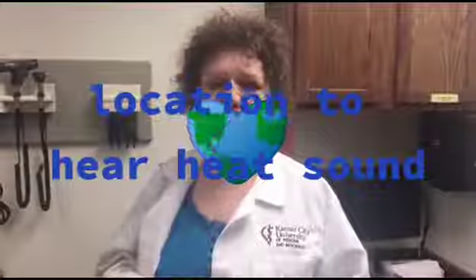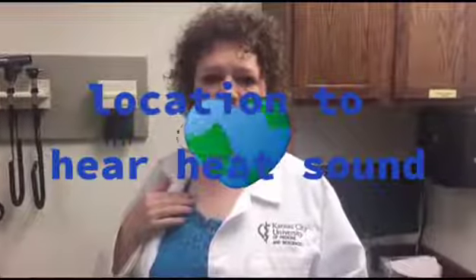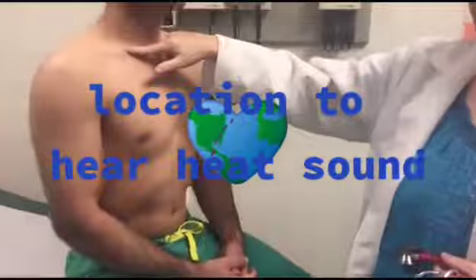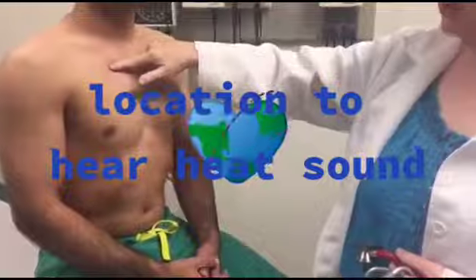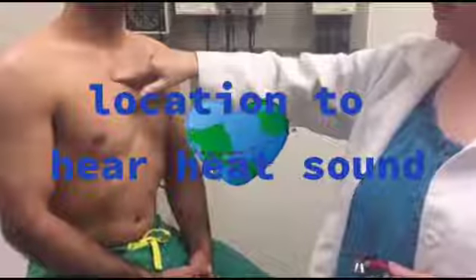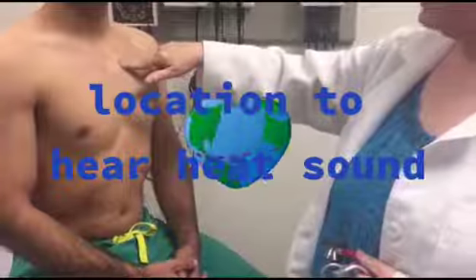Listening post is the aortic valve, and that is on the right sternal border at the second intercostal space. So assuming that his first rib is just posterior to the clavicle, I will take this is the first intercostal space, and there is the second intercostal space. I'm going to go over until I'm just at the sternal border, which is right here. And then I'm going to listen directly across at the second intercostal space on the left.